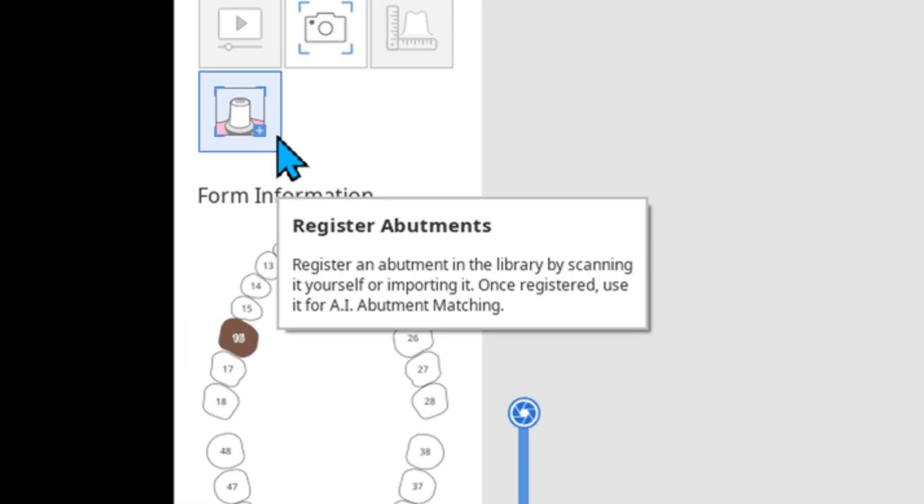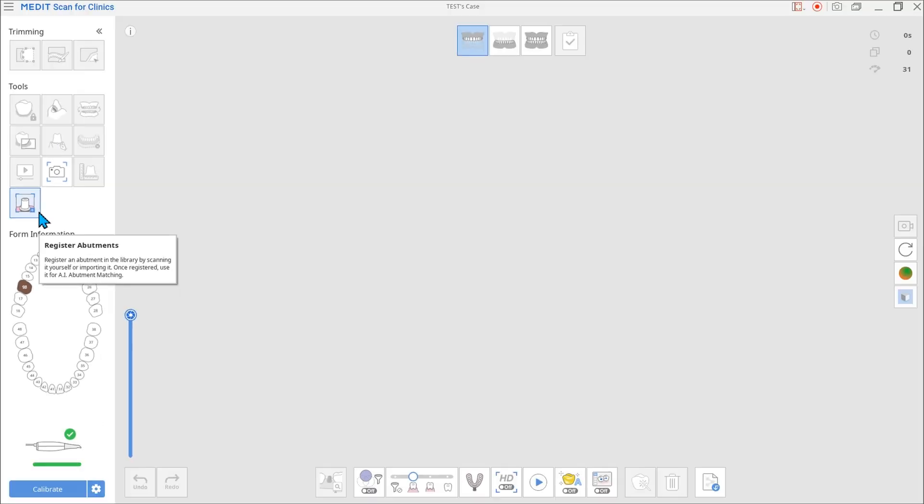You can use the Register Abutments feature to scan the abutment using the internal scanner and register it as a library. After registering the library, you can align it to the scanned data.